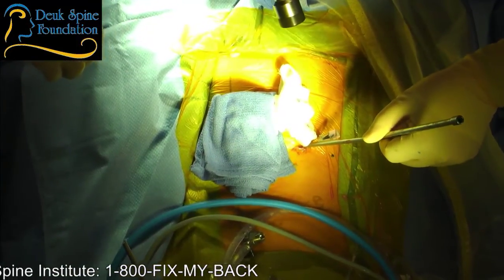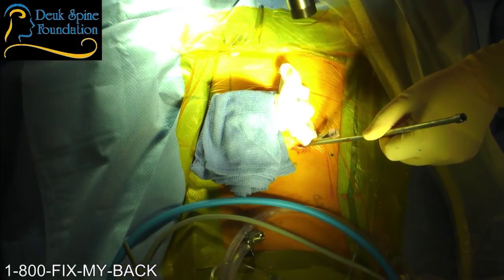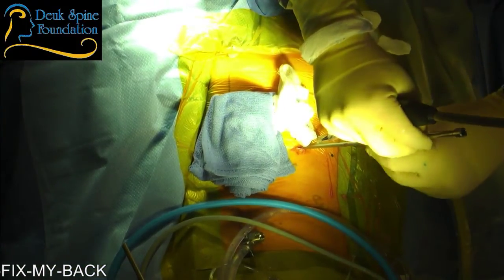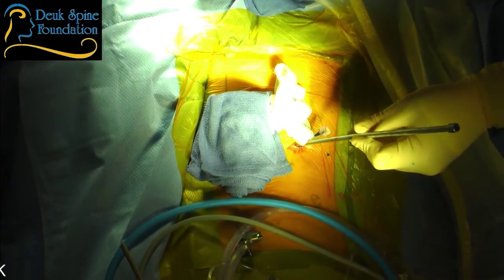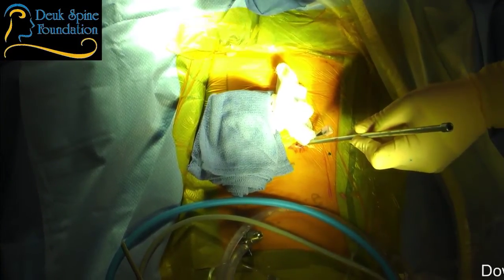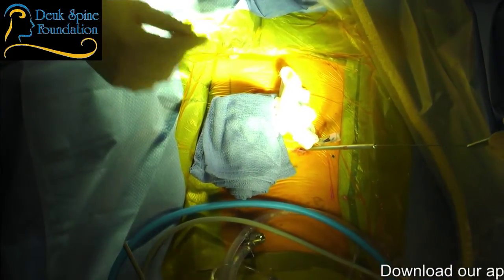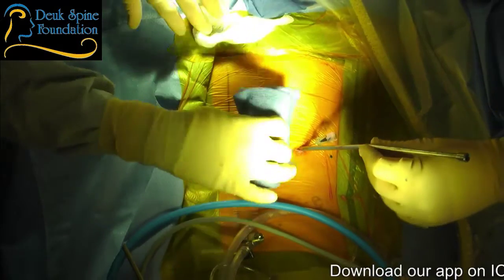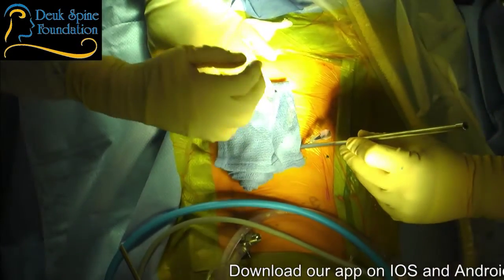Go ahead. One of our viewers asks, what is the recovery time for a surgery like this? One hour. That's the recovery time. When can you go back to work? Tomorrow. As a matter of fact, I've had patients have this surgery and go back to work the same day in the evening. They just can't drive the same day.